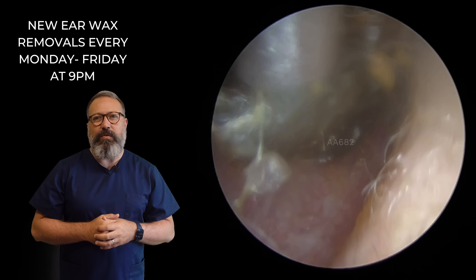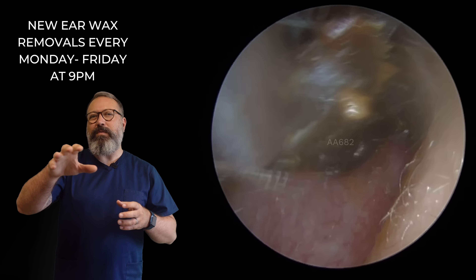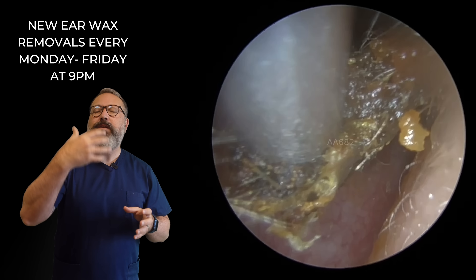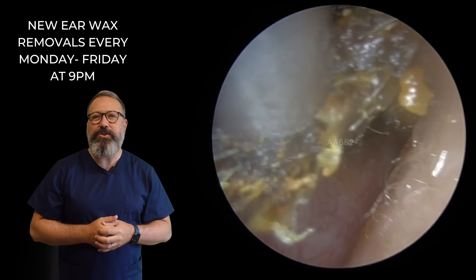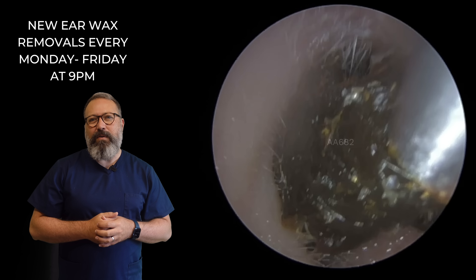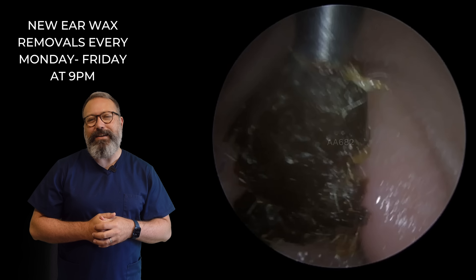There we go. Let's give this a little bit more of a wiggle — it's on its way down. We can see a bit of movement now. We had it moving kind of left and right, now we're starting to get that forward momentum. It's starting to pull out of the ear canal. We've detached enough of it to pull this out. Let's pull this all the way around — out that comes. There you go. So there's that really thick, sticky plug.